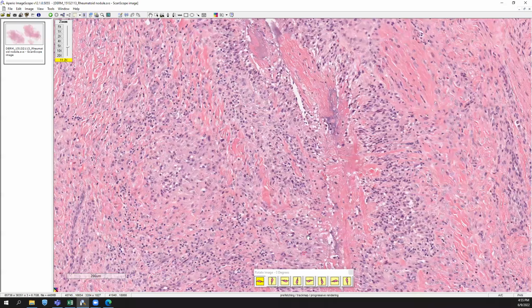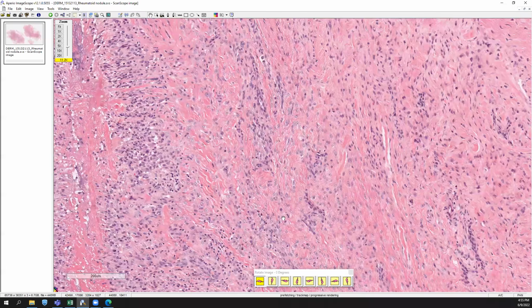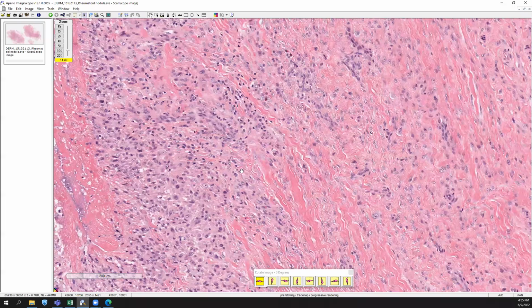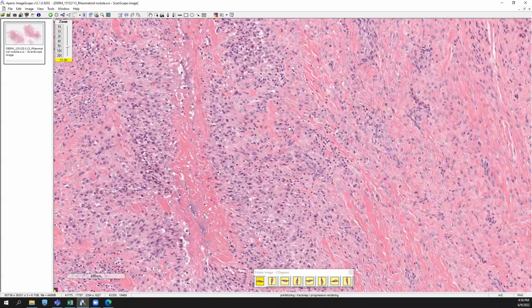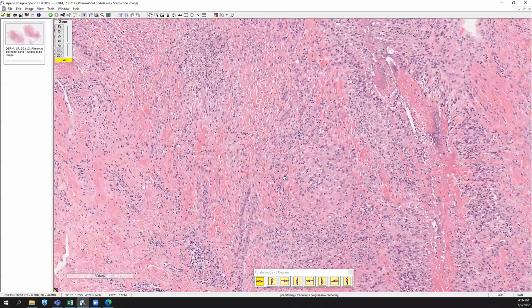You might do a keratin stain to make sure that it's not some type of keratin-derived tumor related to an epidermal cell of origin. You might do an INI1 if you did find some cells that you thought looked atypical, because if you have preserved INI1, that argues against epithelioid sarcoma, because most epithelioid sarcomas actually lose INI1 in the nuclear compartment. So those are just things to think about on the differential, but this is a rheumatoid nodule.